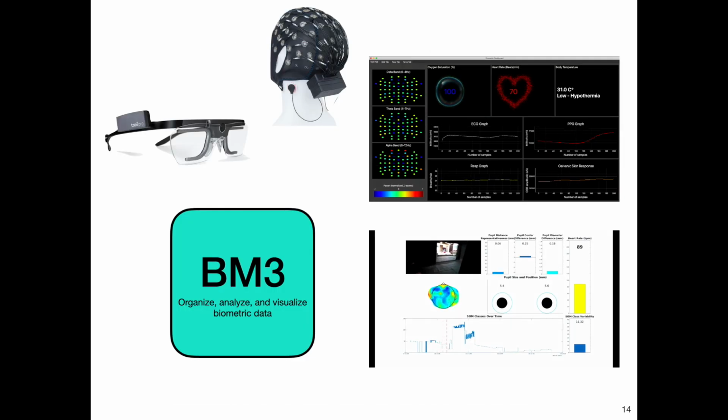Next, we will go through a case study utilizing the sensors and software packages presented here.